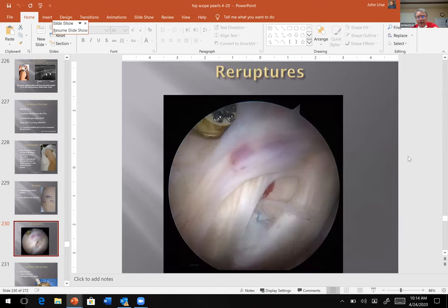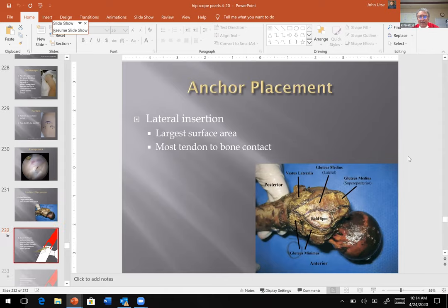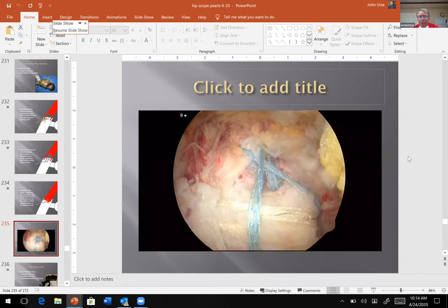Either way, you get in there and find a torn tendon. Some of these re-tear, and you can see suture from an old repair, and they need a graft. But you can see this facet of the trochanter, and this flat area where the medius attaches is pretty easy to put a couple anchors in. We put the anchors in with suture, put them through the tendon, pull it down, and do a double row repair. That's a fiber tape repair that I did on someone.